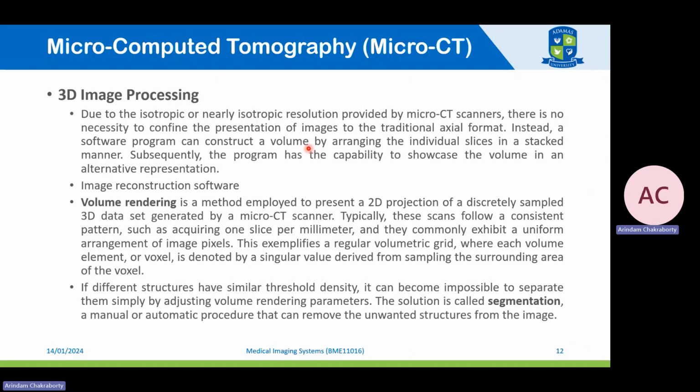There are several highly capable image reconstruction software packages available, both proprietary as well as open source, which can process this micro-CT data. These data are generally captured in what is known as the DICOM format. These DICOM data are processed using these image reconstruction software to provide 3D volume rendering and further processing, for example generation of CAD models for computational simulations, and generation of 3D printable objects, commonly known as STL files for 3D printing.